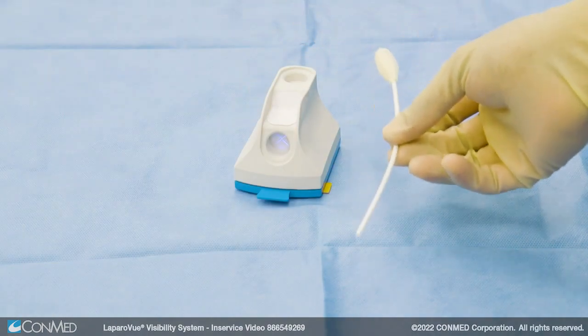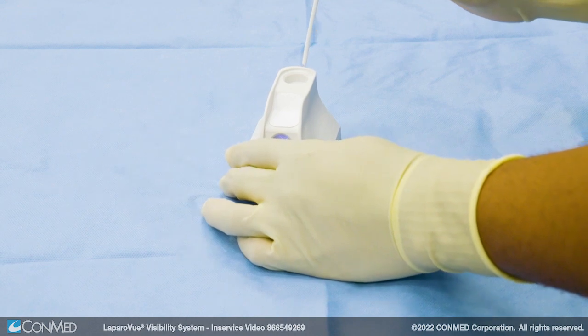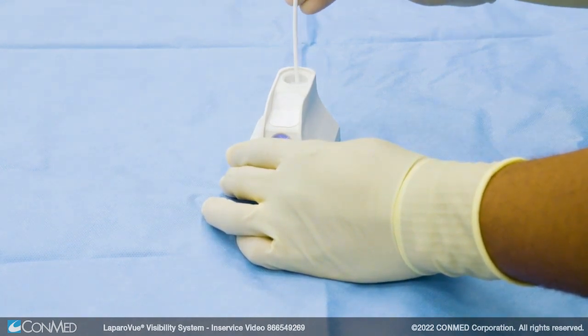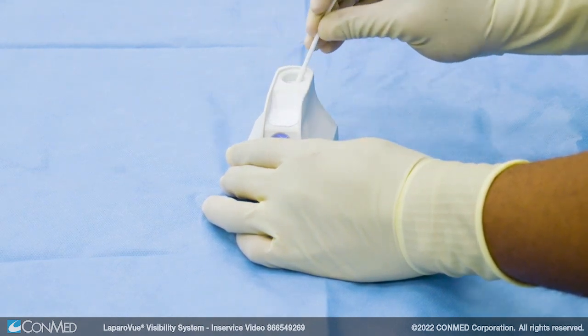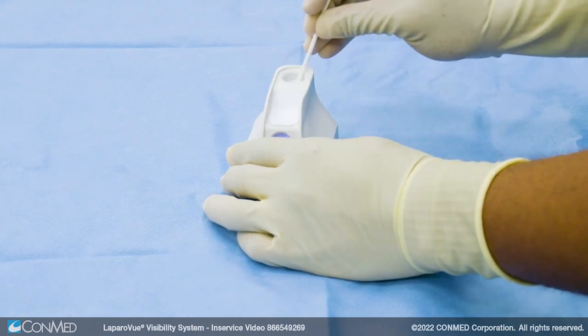Use a view-tip trocar swab to puncture the surfactant cup in the vertical port by vertically inserting the non-sponge end of the view-tip trocar swab until an audible pop is heard. Then rotate the swab in a circular motion to widen the surfactant cup for the scope. This protects the scope from distal tip damage.